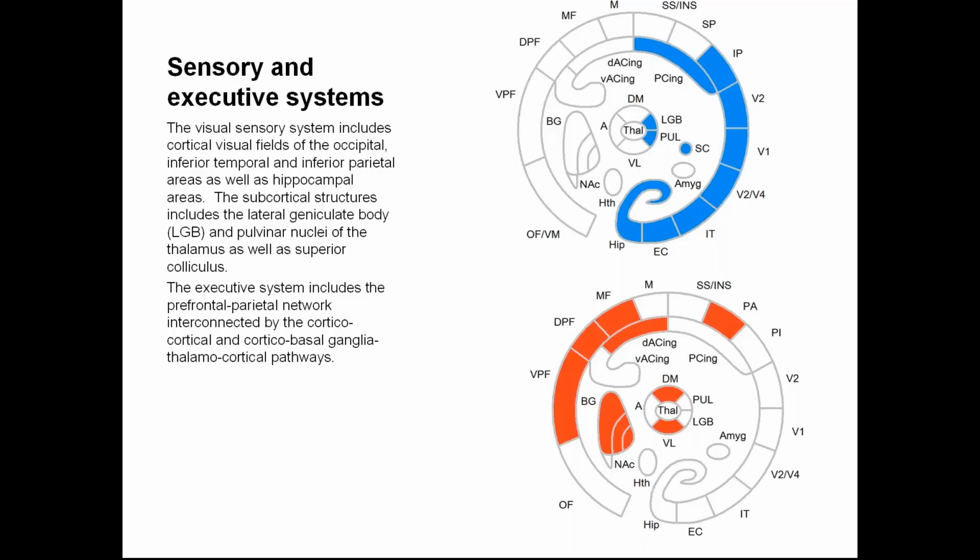But in quite many cases, the QEEG analysis, the comparison of EEG spectra with the database, does not give you any clue, because there are no deviations from the reference. The EEG spectral characteristics look the same in your client as in healthy controls. So the question is, what are you going to do with this client?